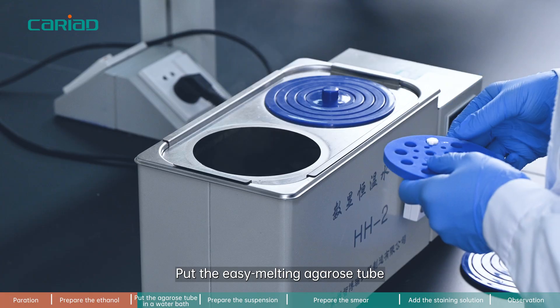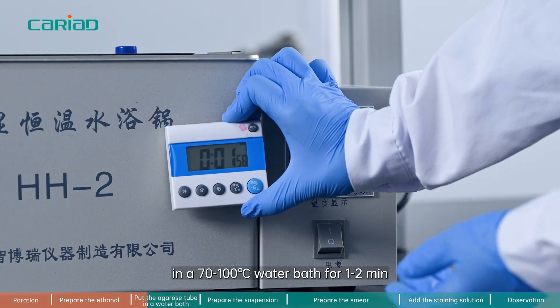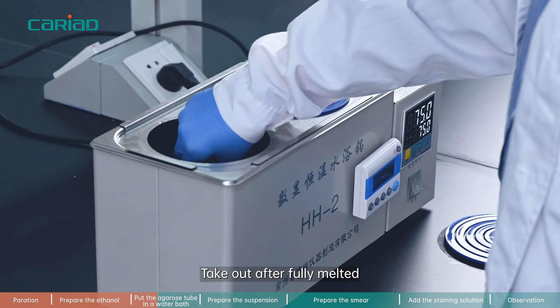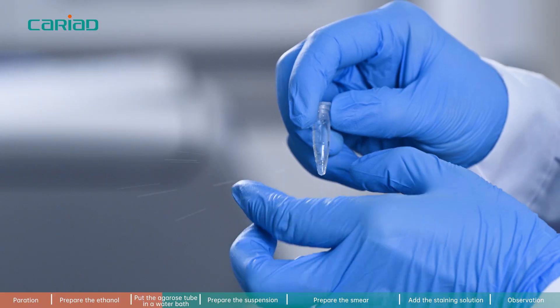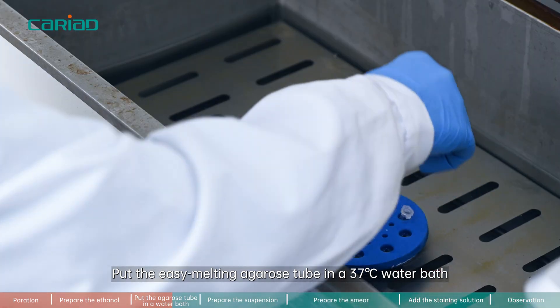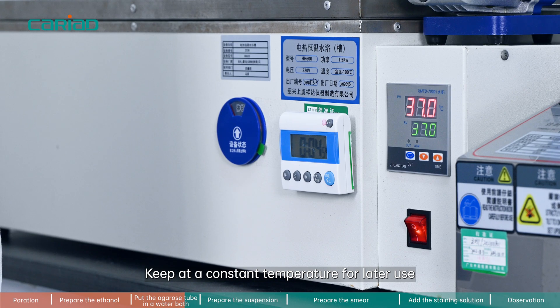Step 2. Put the easy melting agarose tube in a 70 to 100 degrees Celsius water bath for 1 to 2 minutes. Take out after fully melted. Then place in a 37 degrees Celsius water bath for at least 5 minutes and keep at a constant temperature for later use.